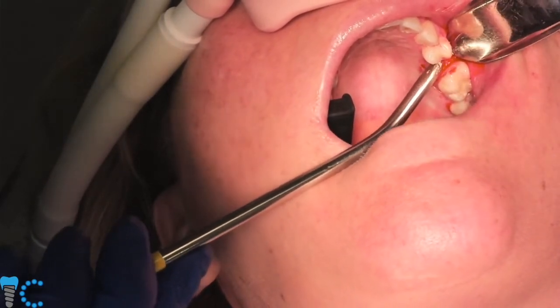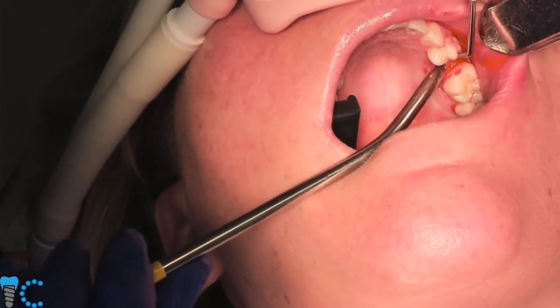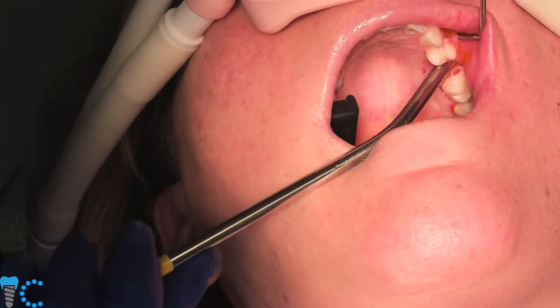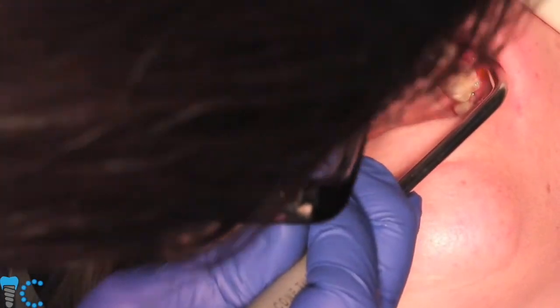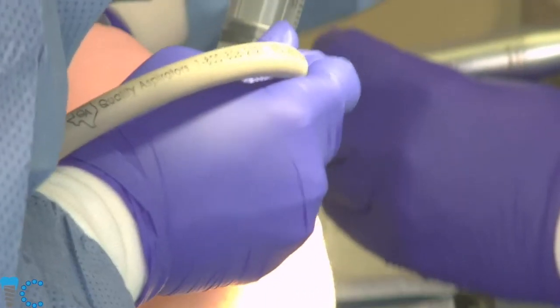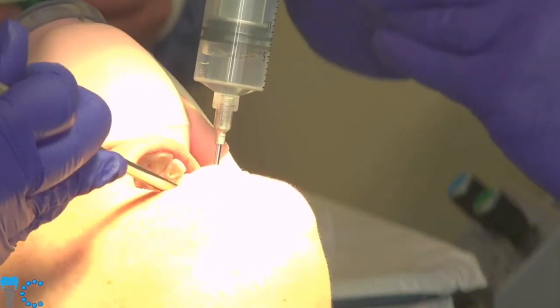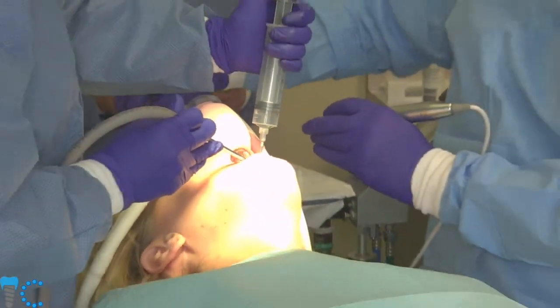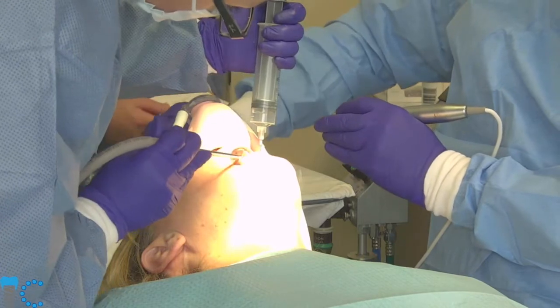So we backed our tap out successfully. And now we have a fully prepared osteotomy. So everything goes as anticipated. We shouldn't really need the handpiece anymore.